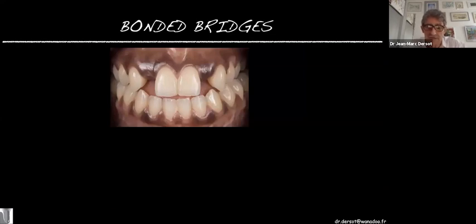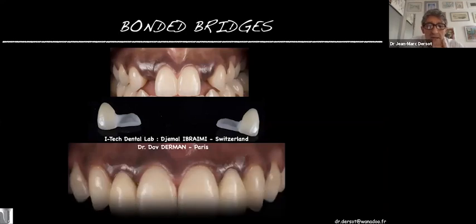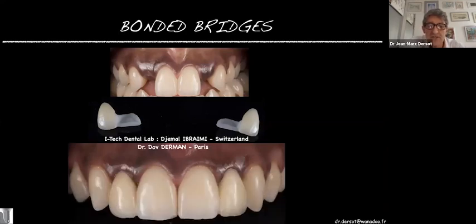Just have a look at this wonderful case. Those photos have been sent by one of my friends. You see the zirconia bridge, only ceramic. This practitioner prepared the gum with a round diamond burr just to create a small concavity. And as you can see, the cantilever seems to come out of the gum. And you see the wonderful result, the wonderful aesthetic result, and the wonderful integration of the gum around the cantilever.